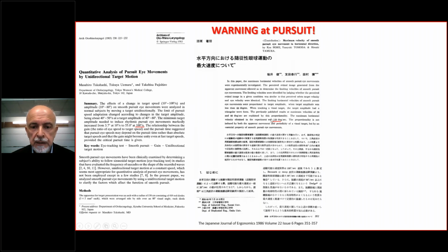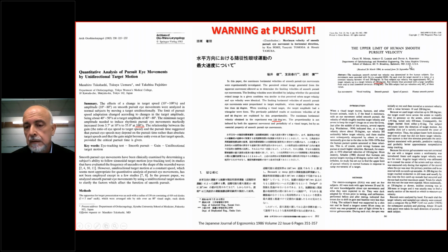or 120 degrees per second, and the last one, 100 degrees per second, is the upper limit of a human smooth pursuit velocity.